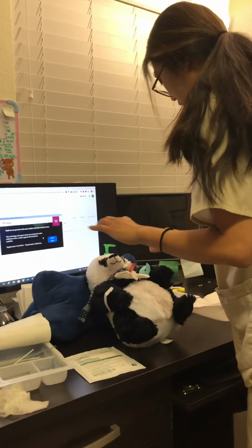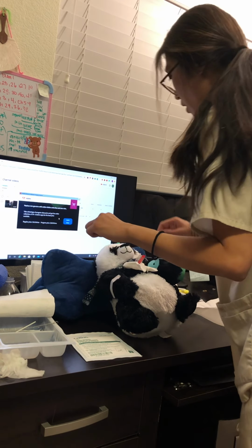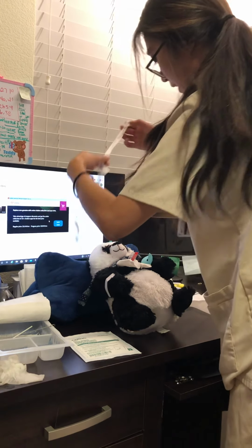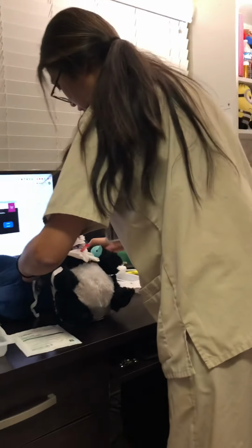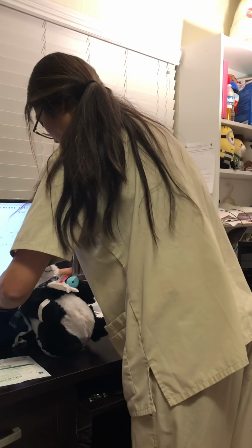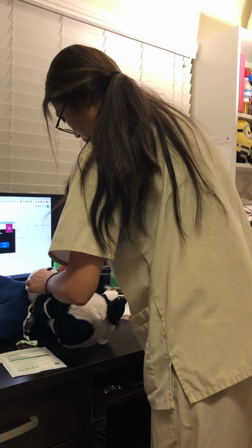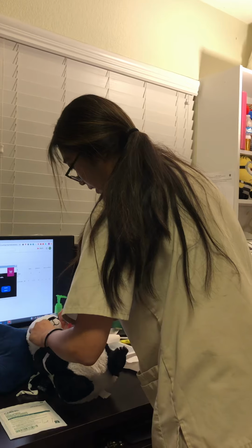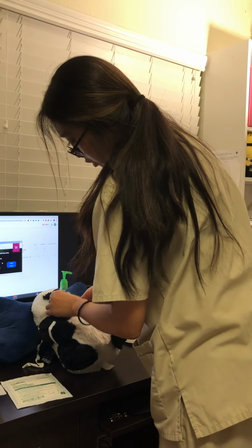Then you would put another tie over this, so that would be over here, and I would then tie the new tie securely, and once it is all secured and tied, then you would remove the older one so it could stay secure. So as you know, I don't have the equipment, so I'm just pretending.